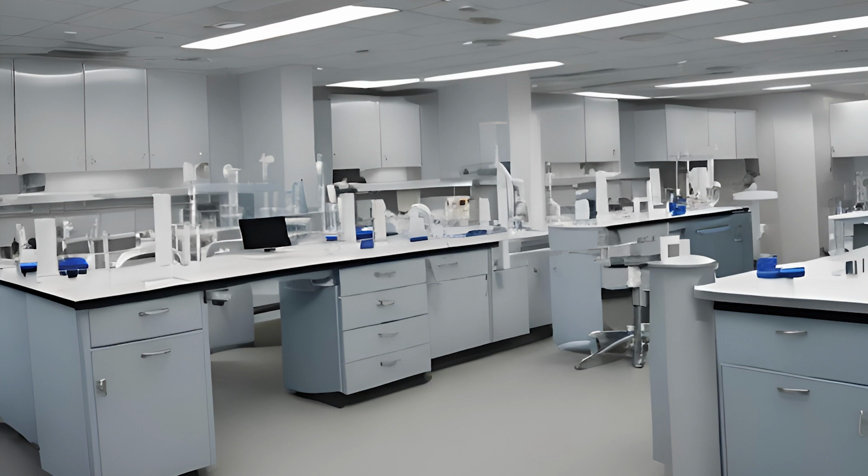When you're drawing blood, keep your patient's arm in a downward position to help maintain the blood flow. Your evacuated tube system tubes, your vacuum tubes, also known as vacutainer tubes, are going to fill until the vacuum is exhausted. They've got a set amount of vacuum pressure inside that's going to fill them to a set level. When they stop filling, they're done. Take your tube off, mix it with gentle inversion, and put your next tube on and collect that tube.